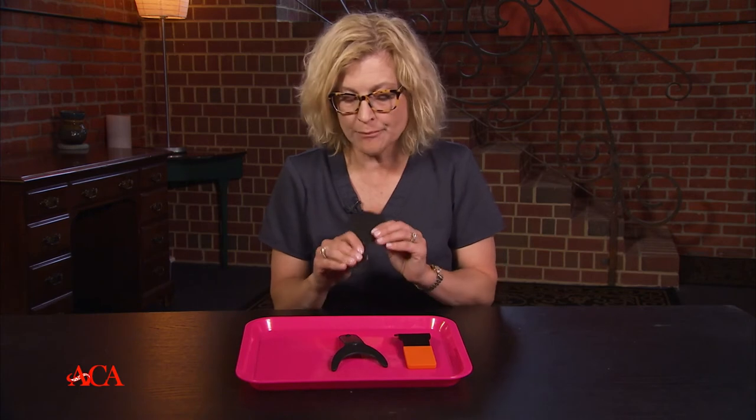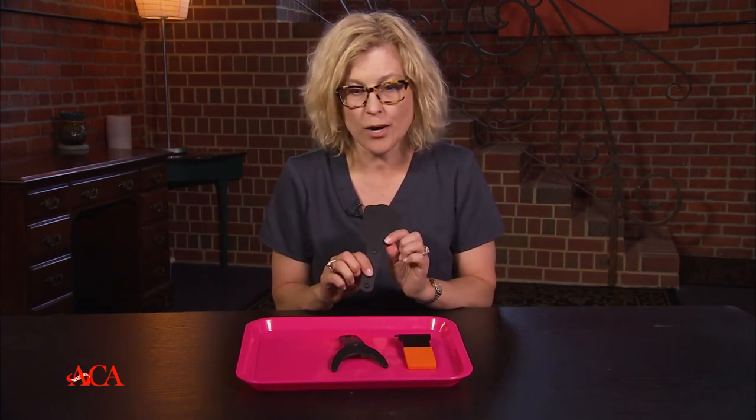The other thing you can use is a contrastor, and there are lots of different options. We could always use our gloves — there are black gloves from Cranberry that I absolutely love. If we can't grab something quickly, we'll just take our gloves and place them behind the patient's teeth. Some people like to take construction paper cut into little squares, or use articulating paper. But what we probably like the most is this little rubber contrastor.